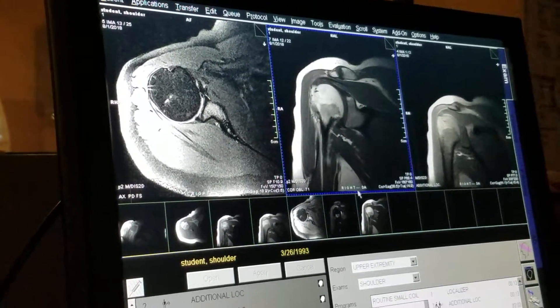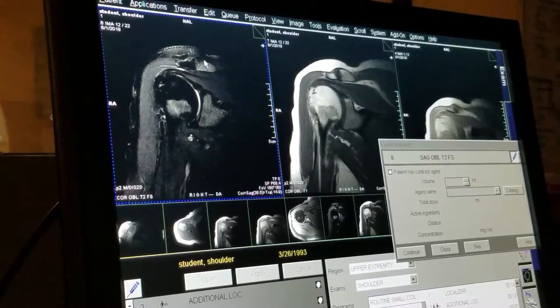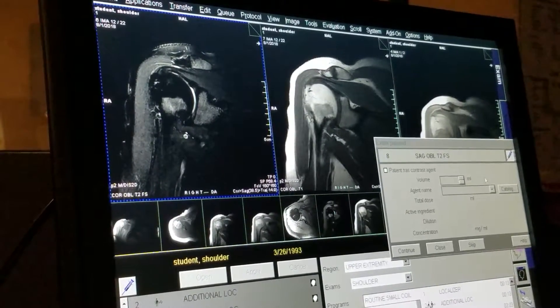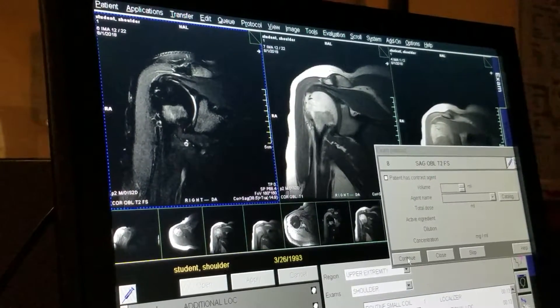We can look at our coronals. Miranda, you doing okay? Yep. Okay. Next one's four and a half minutes.